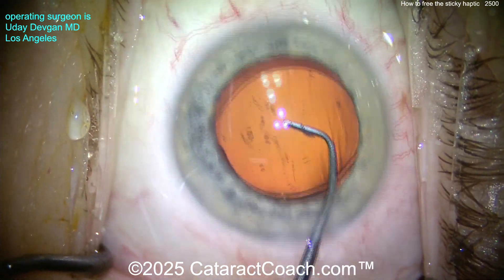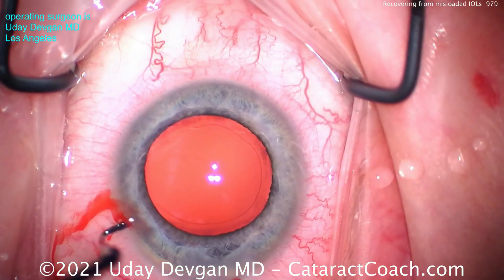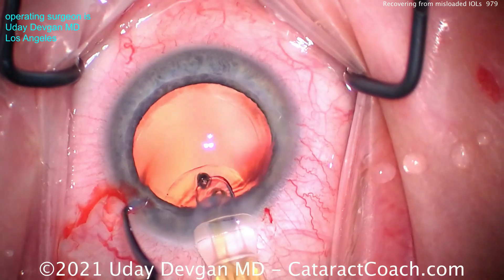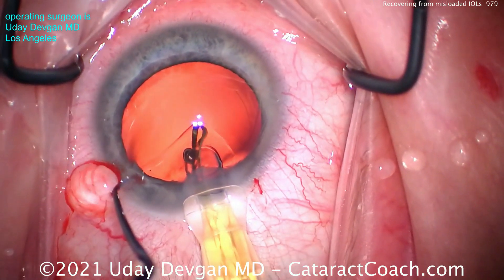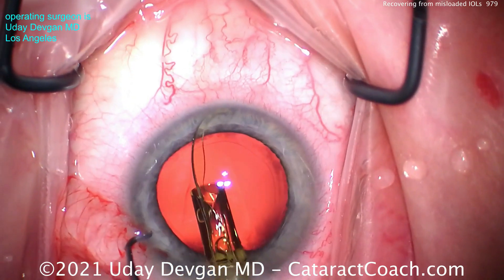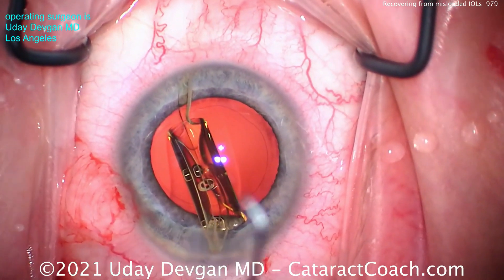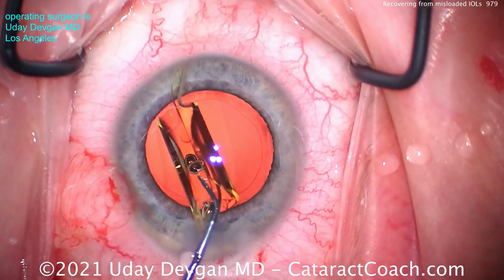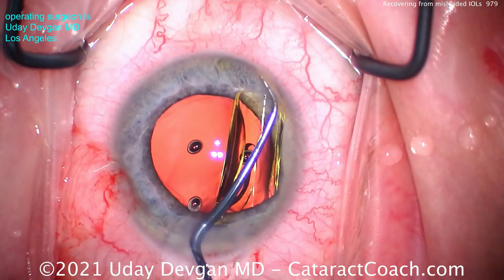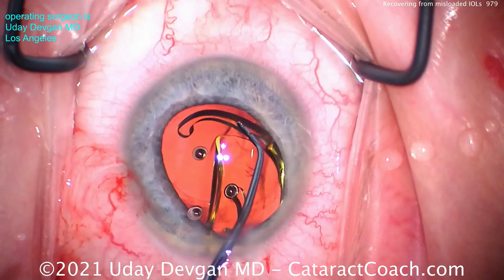I also wanted to address another thing. I saw a video recently where someone called this a misloaded haptic — the 'Superman arm' — because it comes out like Superman. What's the 7L rule? The leading haptic should look like the number seven. That's not a number seven. So what do I do? I don't put it in the bag — I put it on top of the iris. The leading haptic must look like the number seven, the trailing haptic like the capital letter L — the 7L rule, learned on Cataract Coach. Now I can reposition it to get that seven orientation and deliver into the bag.